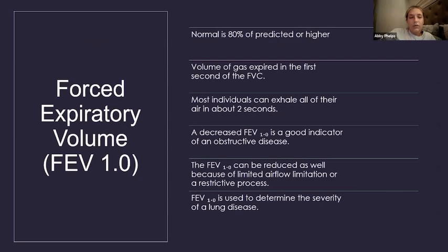So for our forced expiratory volume, your FEV1, normal for this as well is 80% of predicted or higher. It is the volume of gas expired in the first second of the forced vital capacity. Most individuals can exhale all of their air in about 2 seconds.